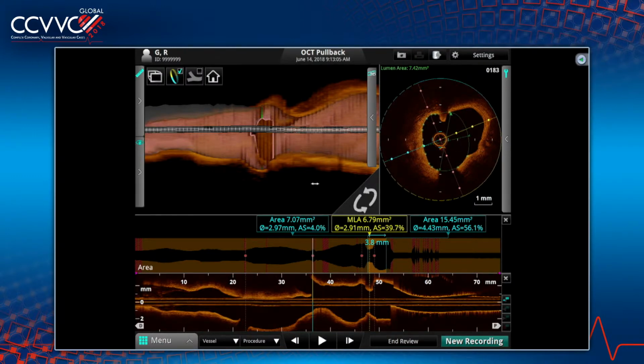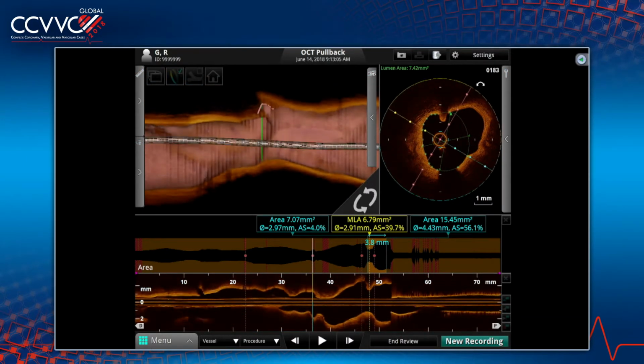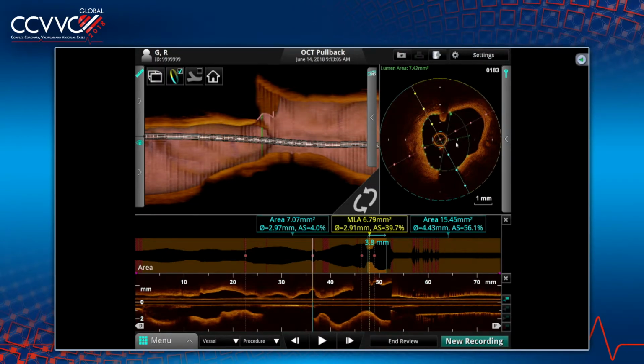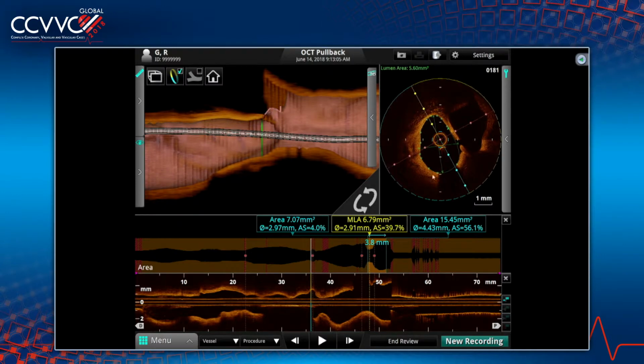Ostium is no disease. No. It's not. We look at it. Look at the 3D. Looks very fancy. That is the opening.